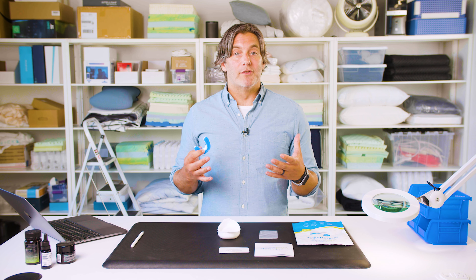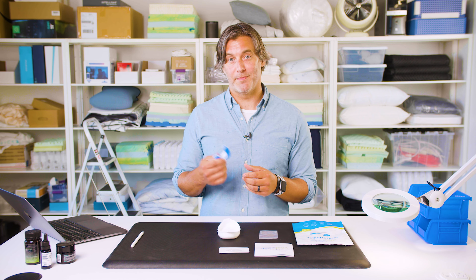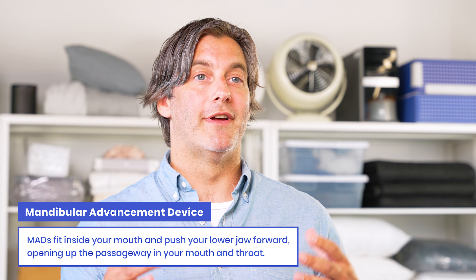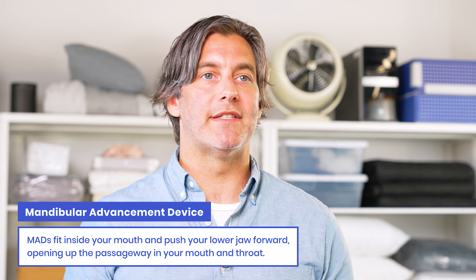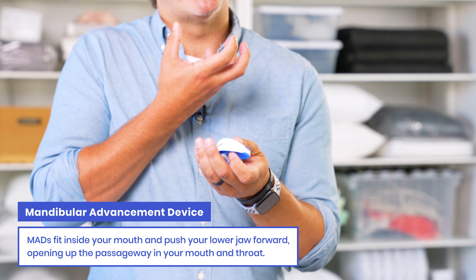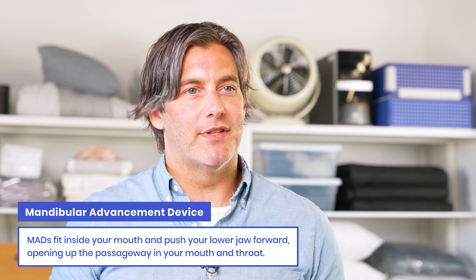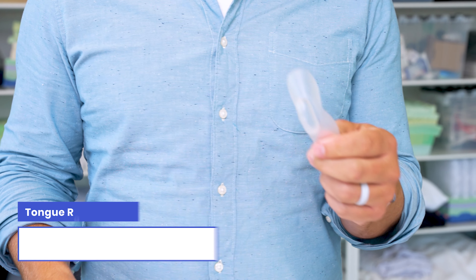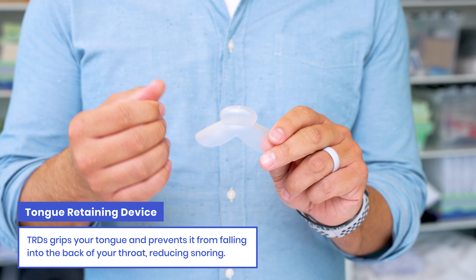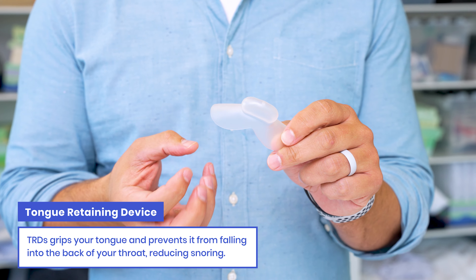Now there are a lot of different solutions on the market. Let's talk about a couple of different mouthpiece devices specifically. The first is called a mandibular advancement device, or MAD. These devices fit inside your mouth and push your lower jaw forward. This opens up the passageway in your mouth and your throat, and it helps reduce the presence of those vibrations. The other device you might see is called a TRD, or tongue-retaining device. These devices actually grip your tongue and prevent it from falling into the back of your throat, also reducing snoring.